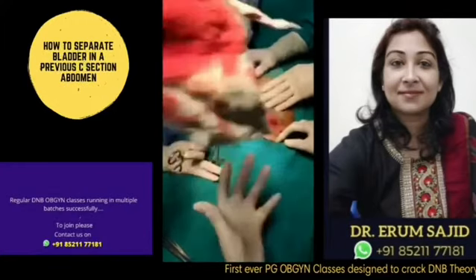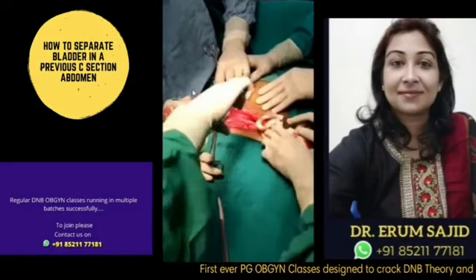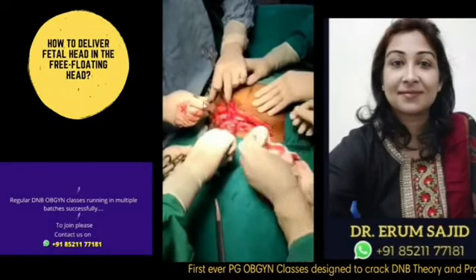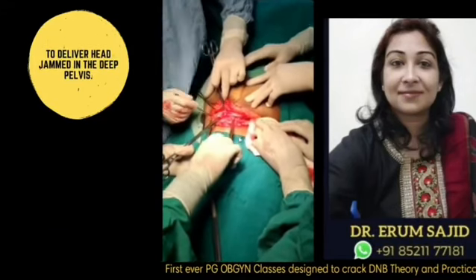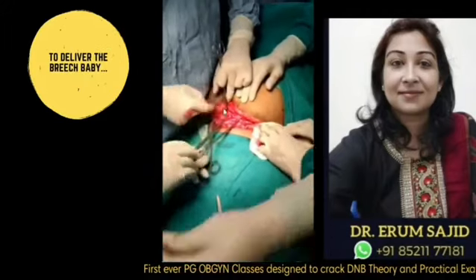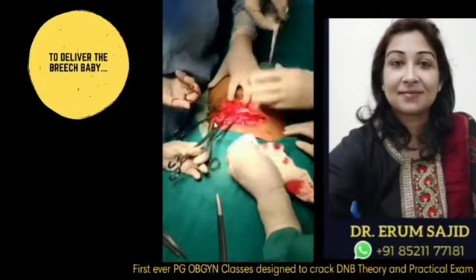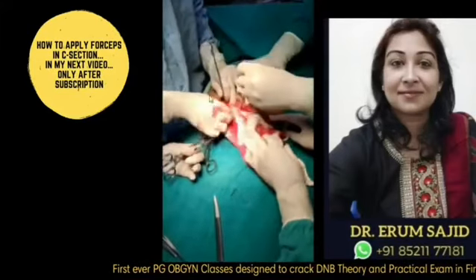Maybe this side it will be a little better. See, have a look, I'm doing the same. Look at the movement of the scalpel. It's beautiful, very superficial, very gentle. Now see, this is called the blunt movement. I'll explain it to you furthermore when I describe the primigravida case, because it's so nicely shown in that.